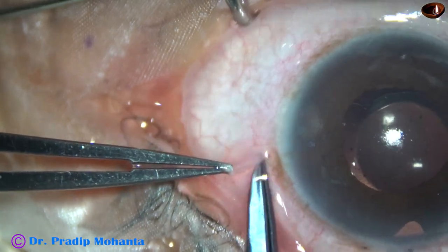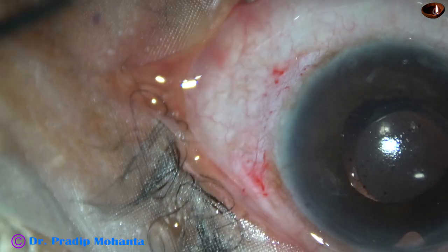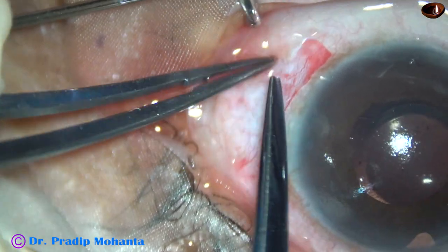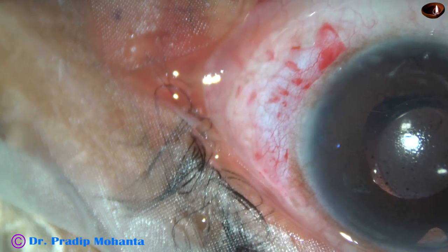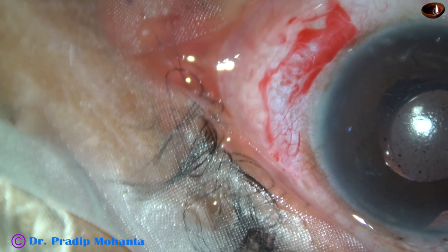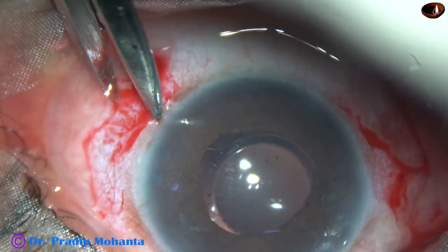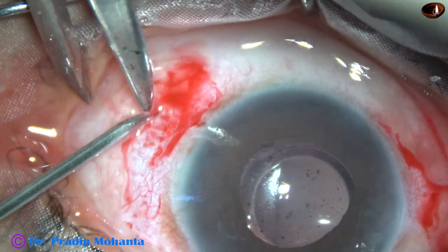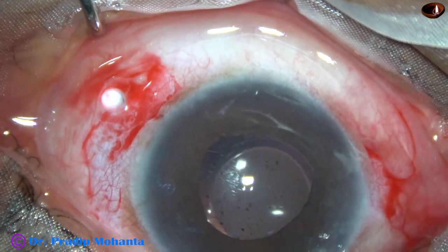For three-port vitrectomy, I am doing conjunctival peritomy for a few clock hours. This is the left eye of the patient and in this area I am going to place two trocars. I use older trocars sterilized by ethylene oxide, and I use a sharp disposable needle of 23-24 gauge first so that the trocar, which has been used several times, can go easily through the track.